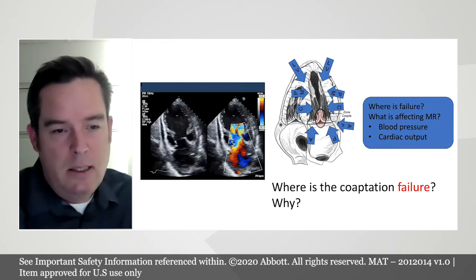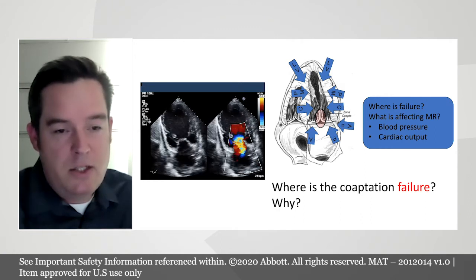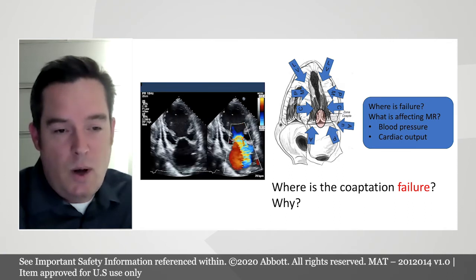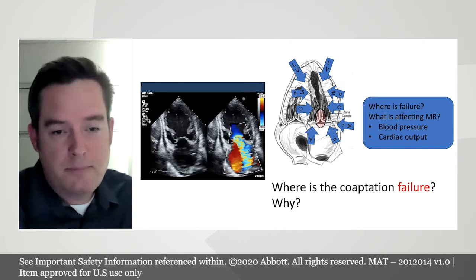What's affecting it? In addition, the patient's blood pressure becomes very important if this is the transthoracic echo or it's TE under sedation. The mitral regurgitation is often easier to quantify in the transthoracic at a normal pressure, as opposed to someone who is sedated receiving a transesophageal echo, where their mitral regurgitation may be less.